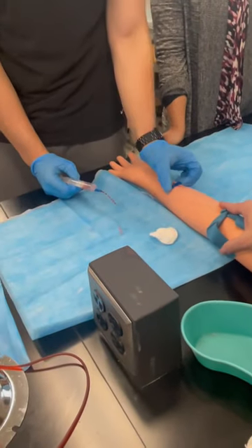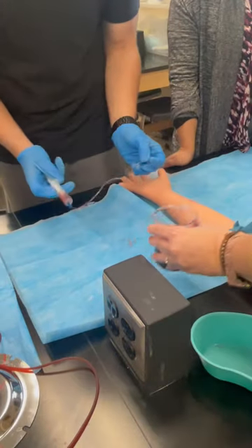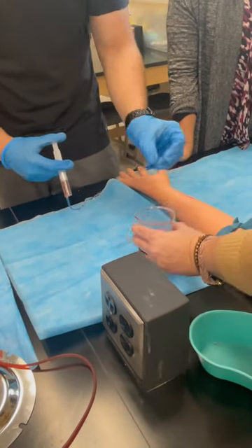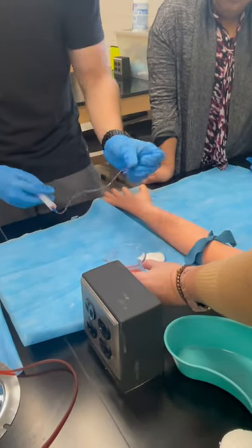Draw yours back out — the whole needle and everything. Push the air into this so we don't push it back into the arm. It's spray so it's gonna do that. Let's try again.